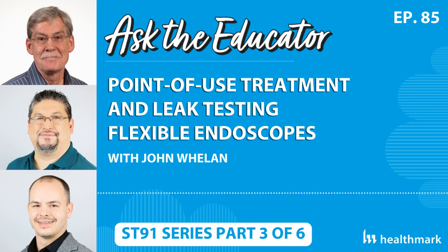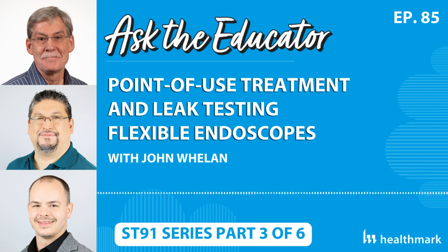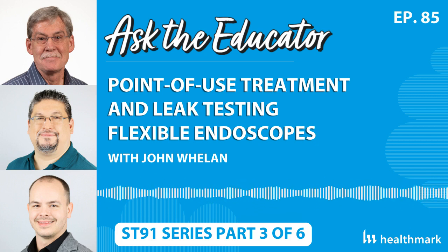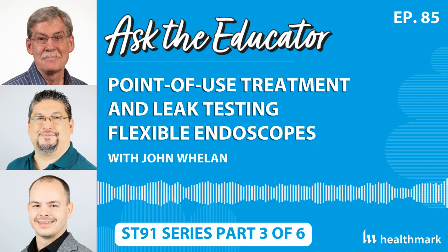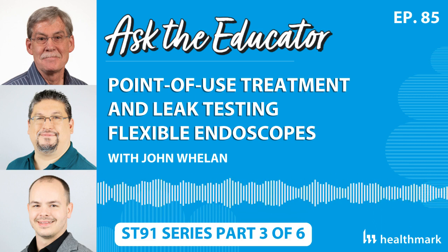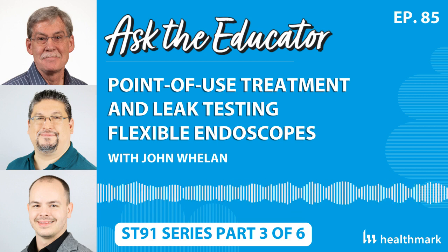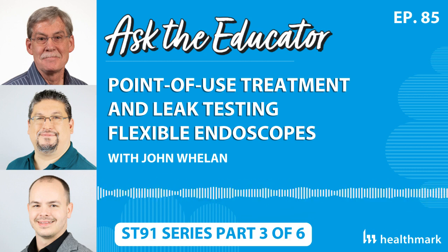If it doesn't deliver the correct PSI, you could be missing some of the leaks, and every leak is significant. So we've stated that every day that they are in use, leak testers need to be quality checked to make sure they're delivering the correct PSI. Some of the automated ones do it every time you turn them on. You need to look at the instructions for the automated ones and see if that is the case. If not, and for the handhelds and the others, there are options available to check the pressures, the PSI coming off of these leak testers.